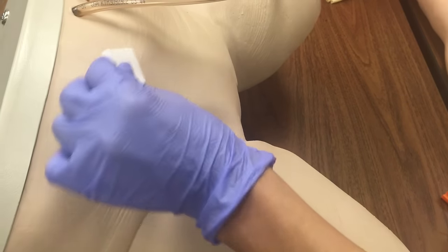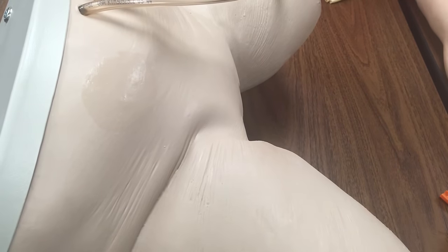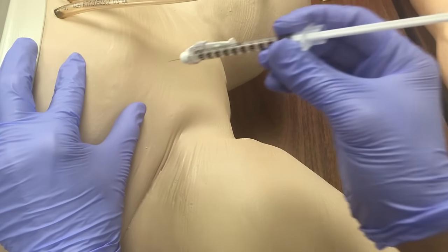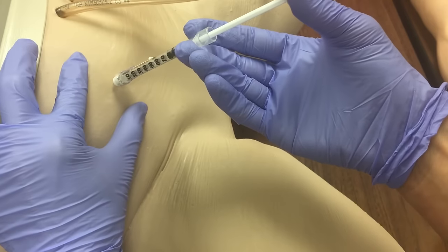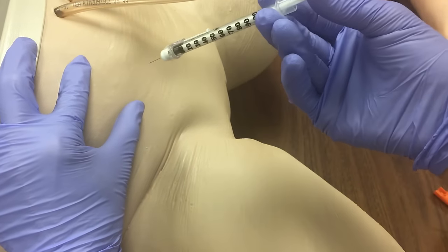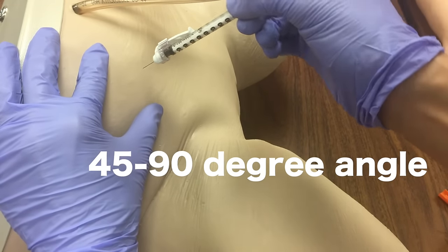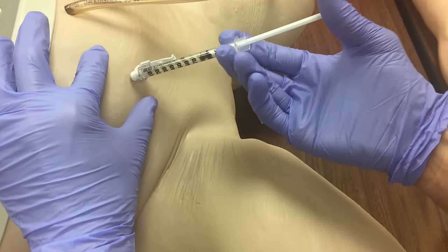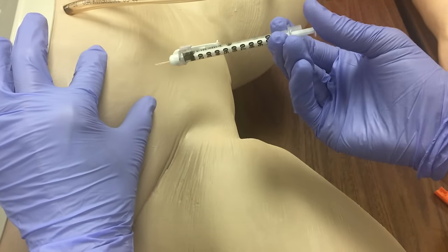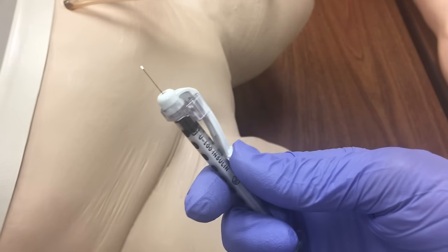Then clean your selected site and allow it to air dry. Pinch up with your fingers, then inject the medication and pull right out. You can go in at an angle — when you select your site just go right in, inject the medication, and come back out. Then you want to activate the needle safety by pushing up on the syringe. Obviously your syringes might be a little bit different.